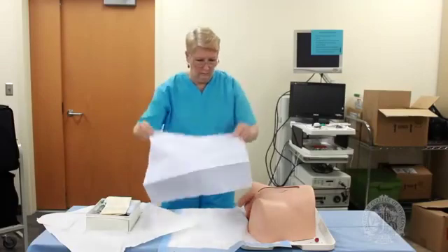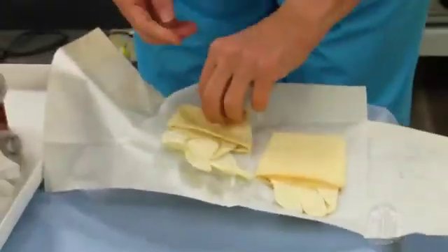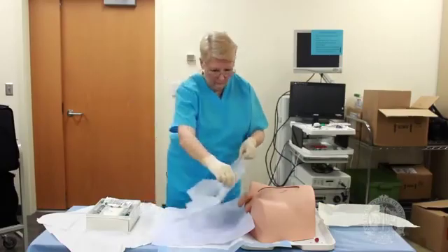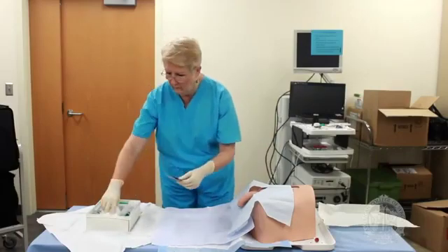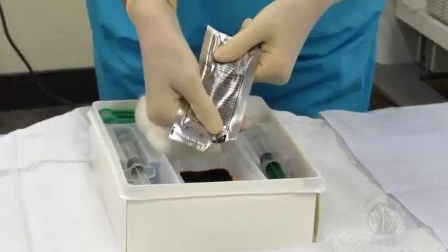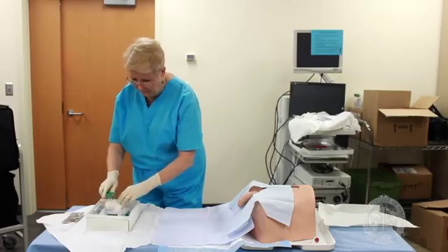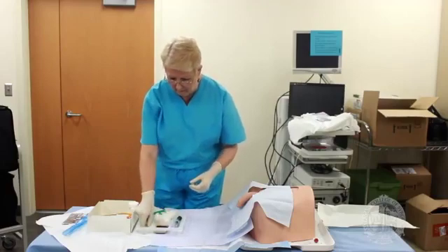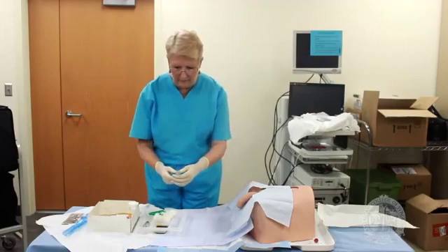Place the large square drape across the thighs and under the penis. Now don your sterile gloves, making sure you have nothing below your elbows such as a watch or ring. Open the fenestrated drape and place it on the patient. Tear open the iodine and pour it into the well in the tray. Lift the top tray out and place it in the sterile field in front of the rest of the box containing the actual catheter and tubing. While it used to be commonplace to check the balloon by instilling it with the provided saline, the manufacturer and most institutions no longer recommend this step — check with your institution to determine their policy.